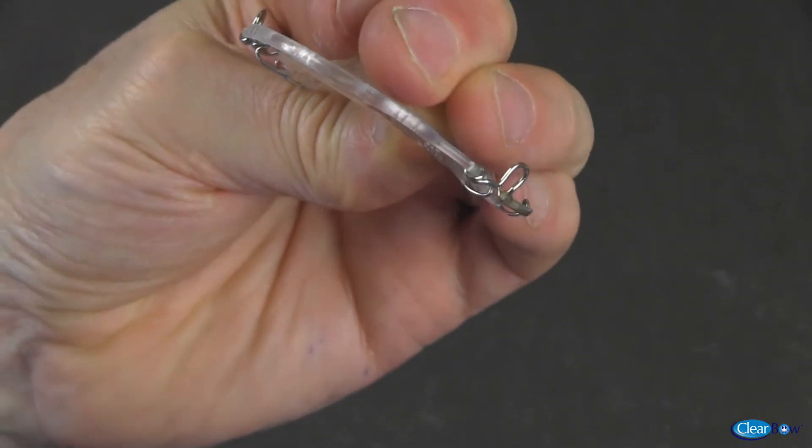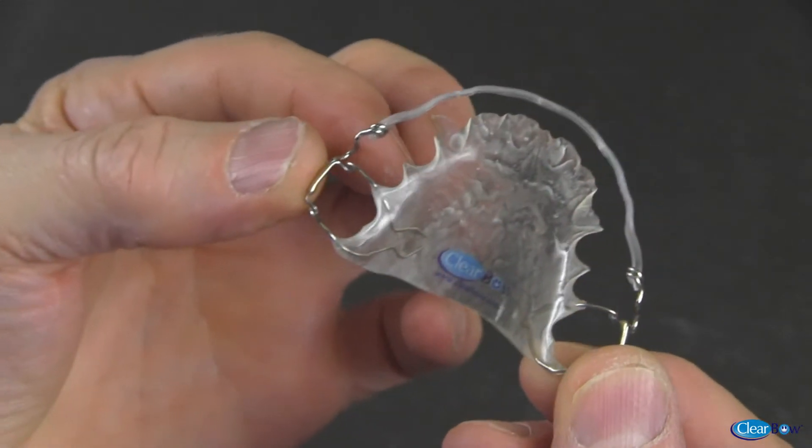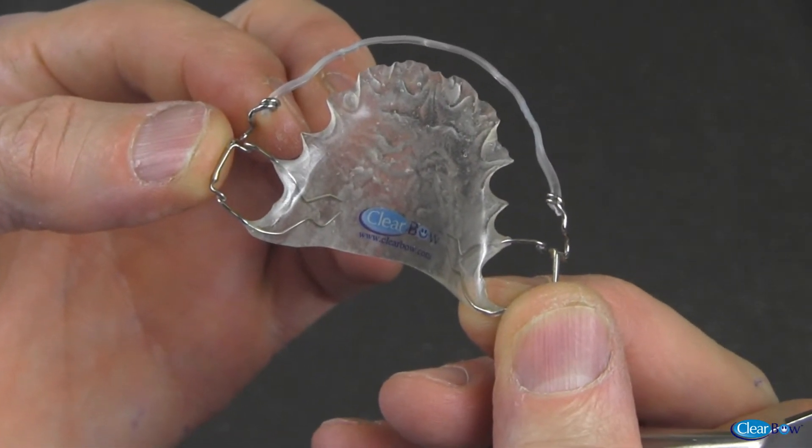The ability to adjust the clear bow without fear of breakage is one of the many reasons that make it the clear alternative for a superior orthodontic appliance.